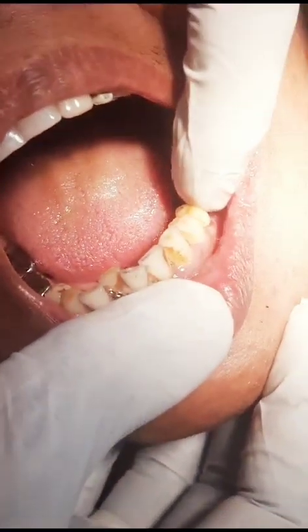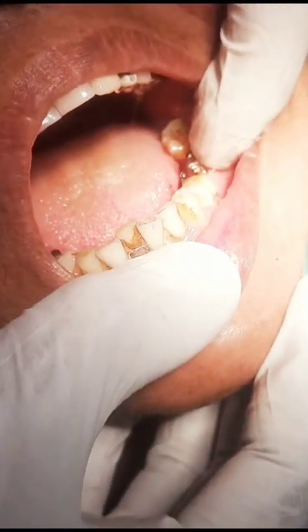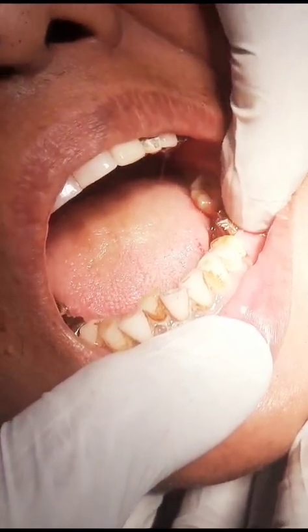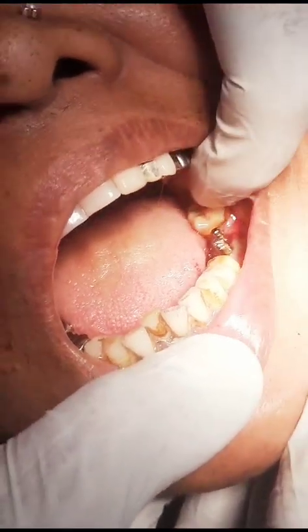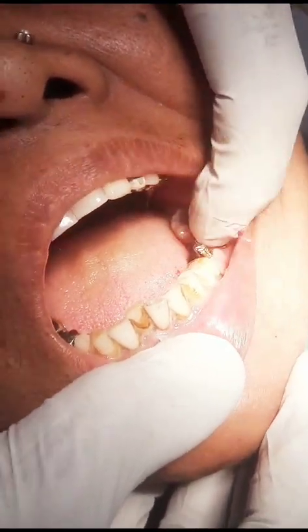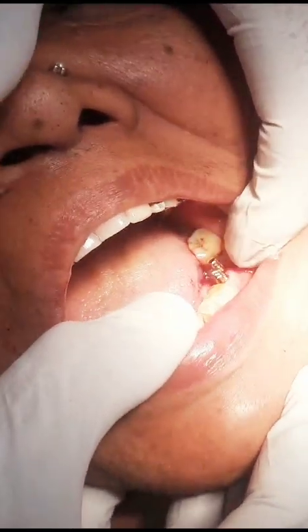This tooth was already cut by another doctor earlier, and two teeth were cut and a crown was fixed. Now because this tooth has gone, she doesn't want the remaining teeth to be cut. So I have placed two implants here and we will have around three fixed teeth — one mounted on 35, 36, and 37.